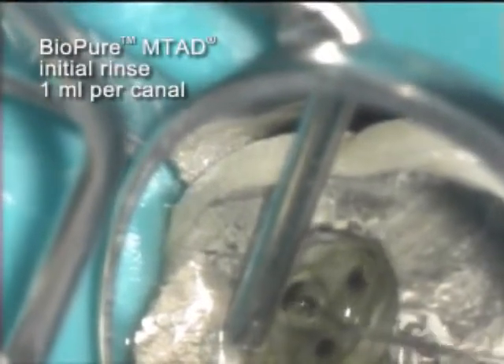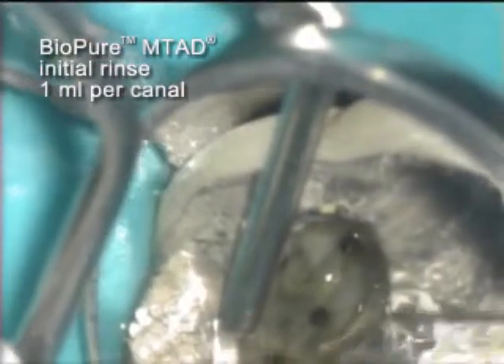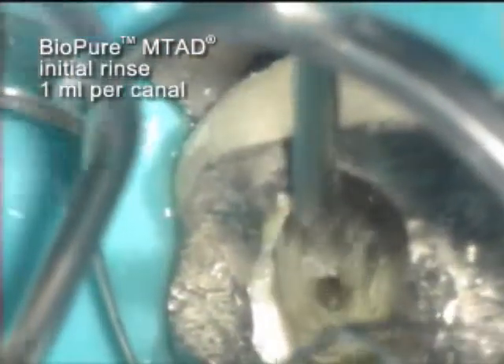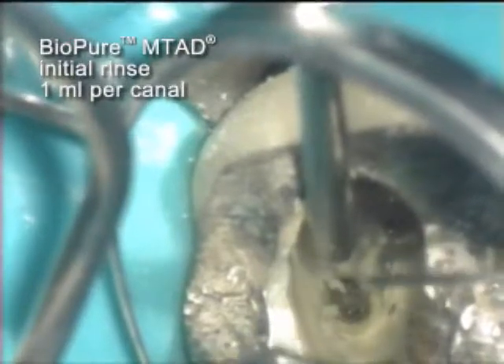Each canal receives one milliliter of BioPure MTAD. Delivery is as close to the apex of each canal as the 30-gauge side-vented needle will allow. During the initial application of the BioPure MTAD, the palatal canal presents an obvious reaction.